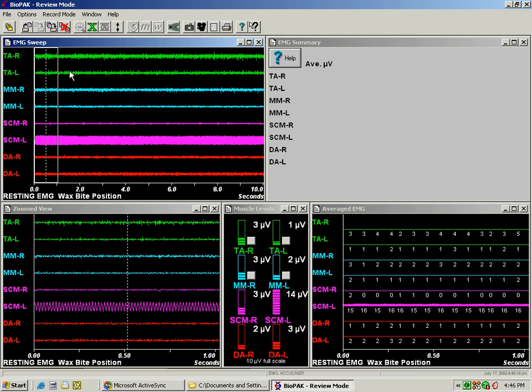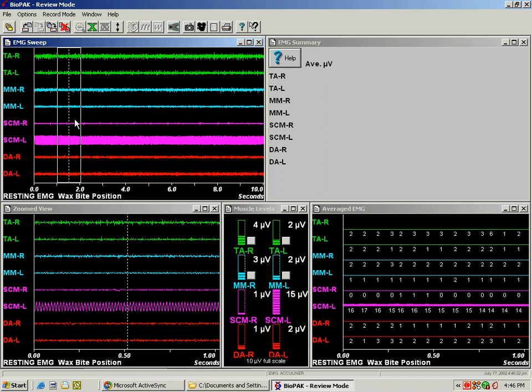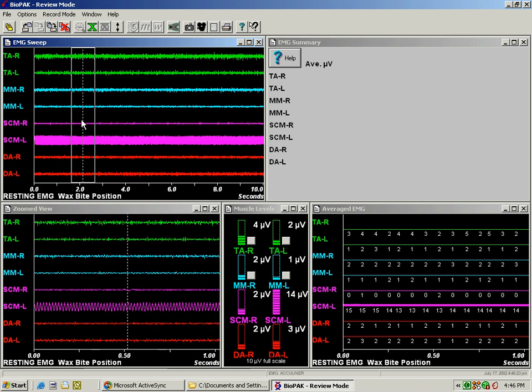The windows are the EMG sweep here in the upper left hand corner, the summary or the numbers in the upper right hand corner, the zoom view, that's what we see anywhere that we move this vertical cursor in the sweep view, is blown up down here in the zoom view.